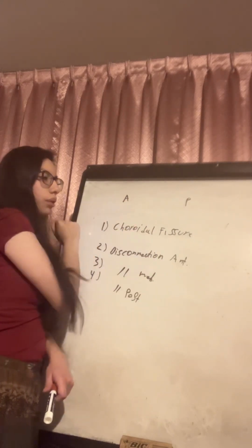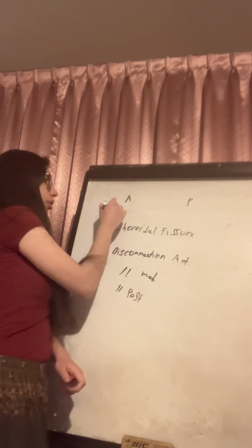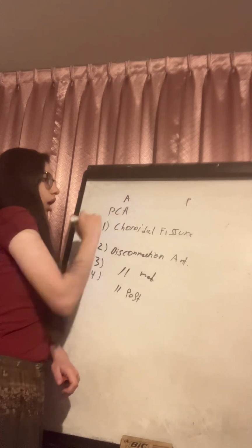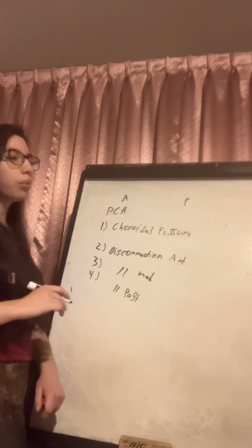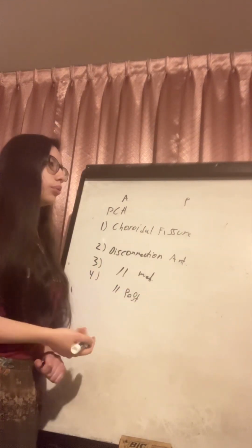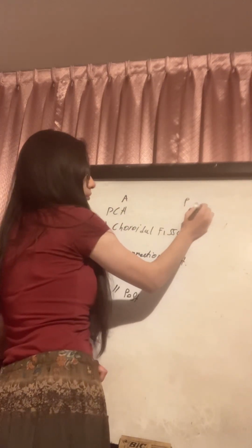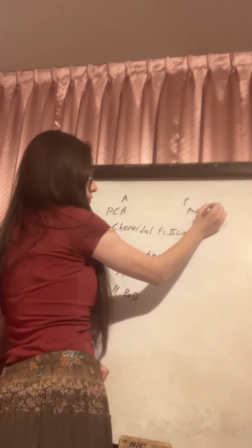On the anterior segment or portion, we will see the posterior cerebral artery, and in the posterior segment we will see neural structures that are below the hippocampus, for example the parahippocampus.